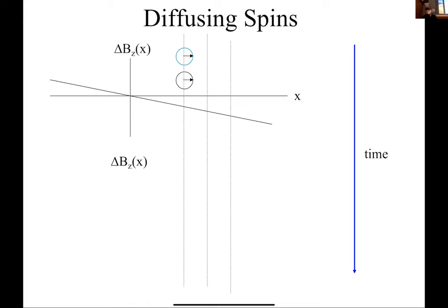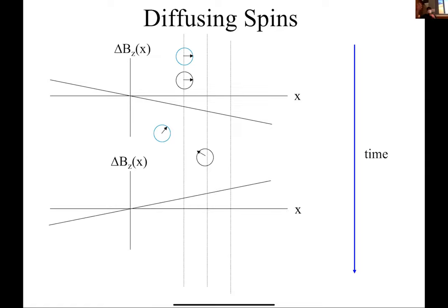So you remember from last time, the basic idea is if you have spins in the presence of gradients, and these are what we call bipolar gradients, where we turn them on for a certain amount of time, then we wait, and then we turn them in the opposite direction for the same amount of time, and then we see what happens. Because spins are moving around, they're experiencing different parts of the magnetic field that we've imposed, this linearly varying magnetic field. So even when we refocus it, if the spins stayed where they were, they would acquire no net phase because whatever additional field we gave them, we subtracted it later and the field balanced out. But if they move around, they sample different parts, so they're not going to get rebalanced, and they are going to acquire a net phase.